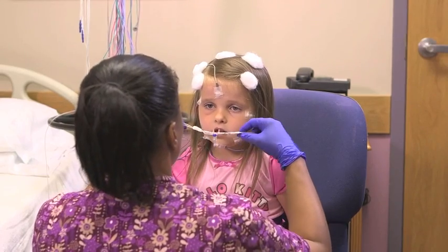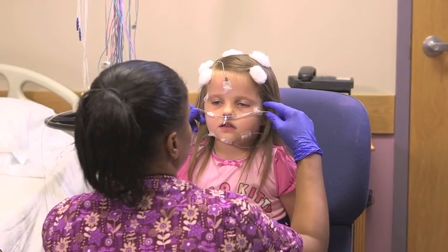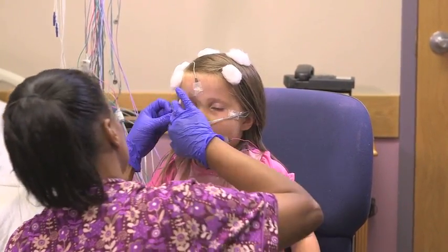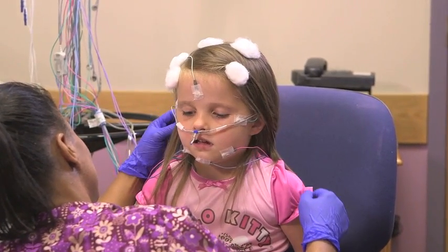There's nothing that we put on your child that doesn't have a particular purpose. One of the things that we put on the child, and it's the most important one, is the airflow sensor and nasal cannula that goes right underneath the nose and above the upper lip. This may tickle or even agitate some patients, but like I said, it's probably the most important thing because this rules out any kind of breathing disorders that your child may have.